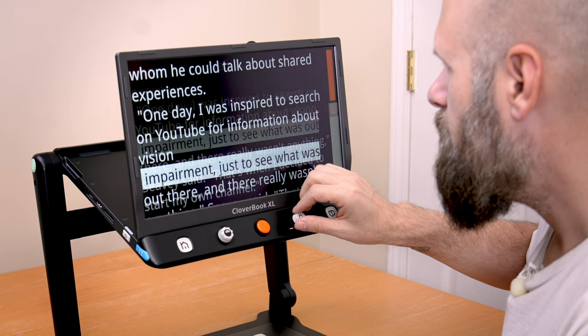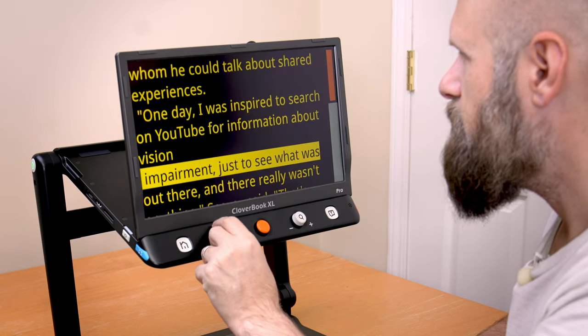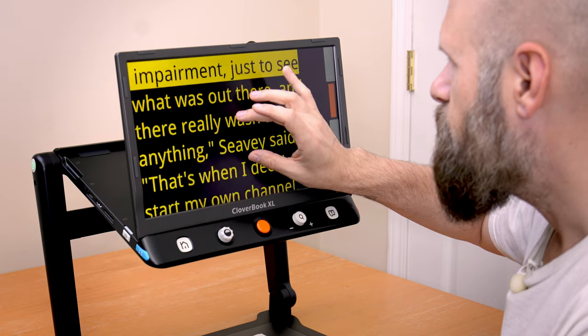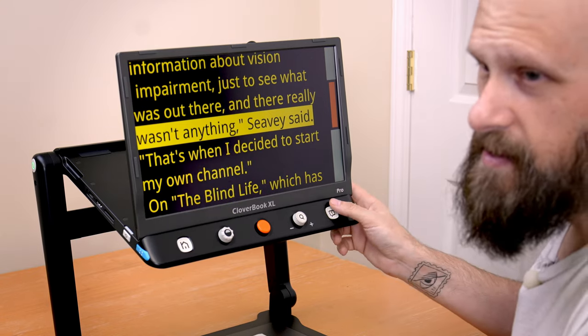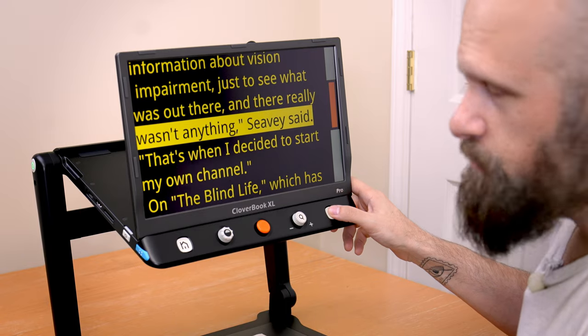In text mode, I can zoom in to make the text larger, change colors, use the joystick to move the text around, and pinch to zoom. You have on-screen controls, but you can also just press the text-to-speech button to play and pause the speech.